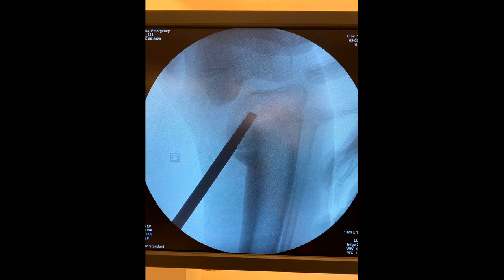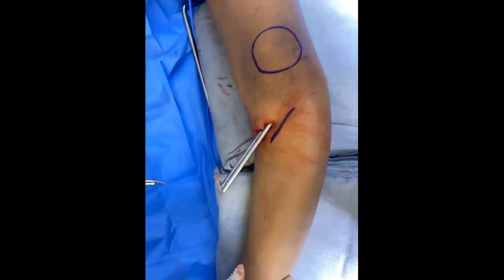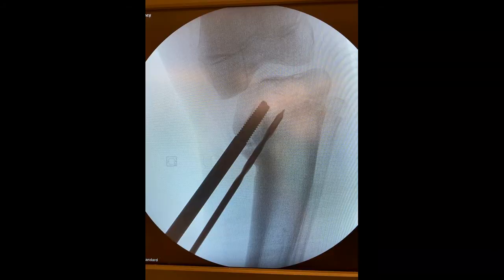We perform the fibular osteotomy, resecting a structural bone graft of about 2 cm in length. We perform a surgical approach in the same direction as the proximal pins, 2 cm distal to them.